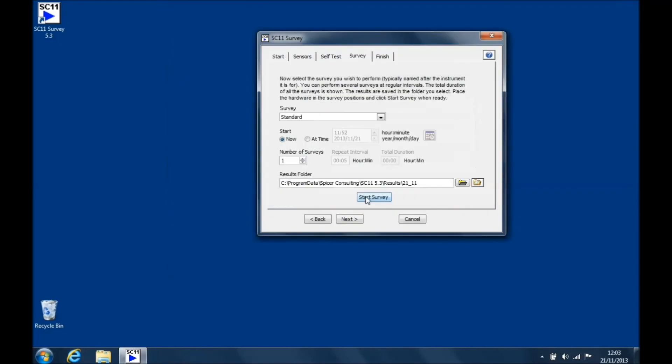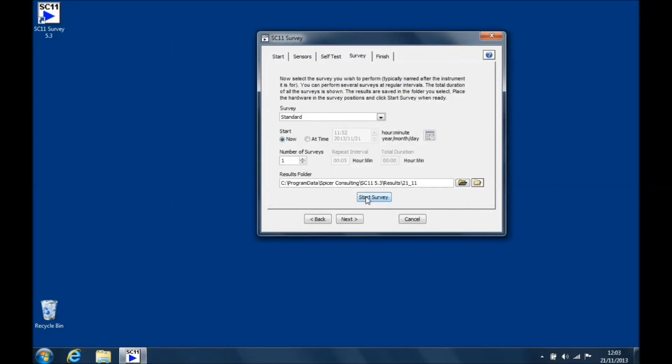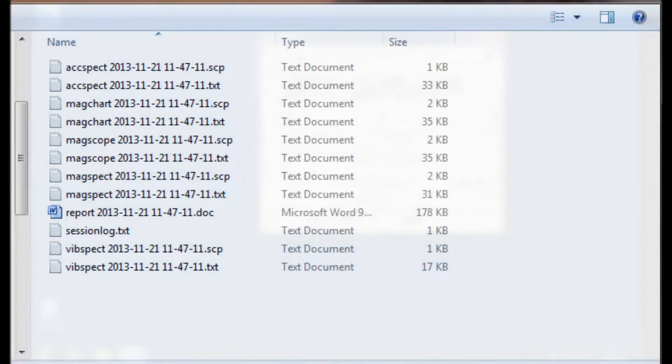Open up the results folder to view the measurement files and the report. The report and measurement files will help inform a decision of whether putting the machine in that location is suitable or not. If that location is not suitable, but you still want to install a microscope there, Spicer Consulting provides solutions to magnetic field problems. Check out our website for more details on the SC20 and the SC22 cancelling systems.